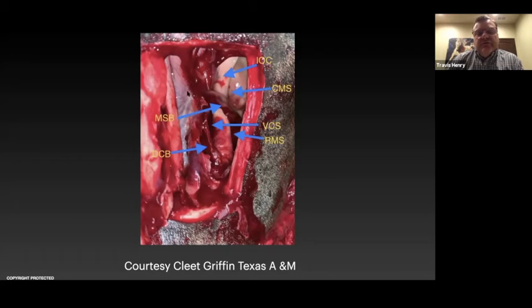So this is all frontal, or surrounding us here. So this is the bulla, and it was all full of inspissated material, and they made their access into this to debride and clean that out through a frontal approach.